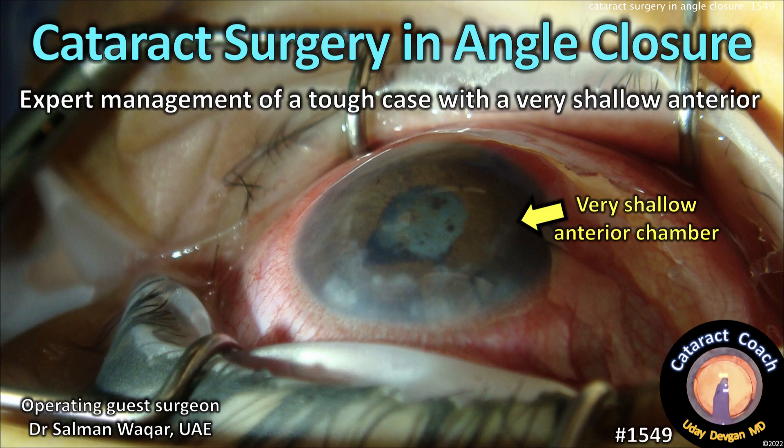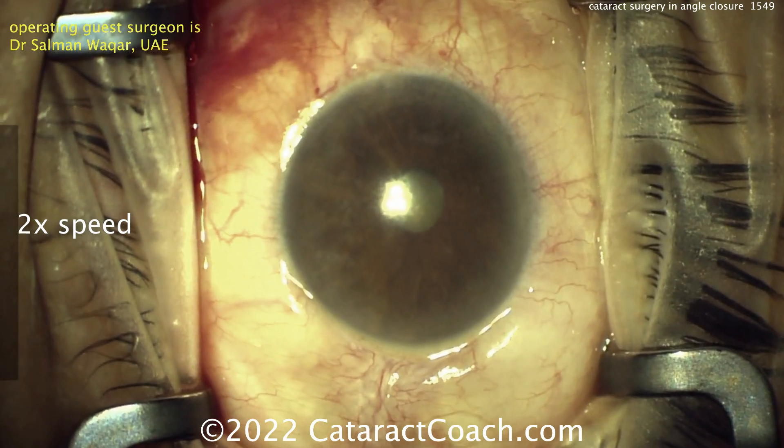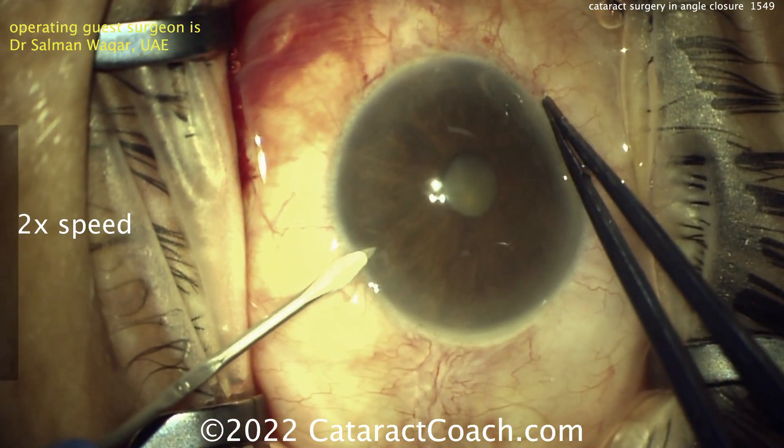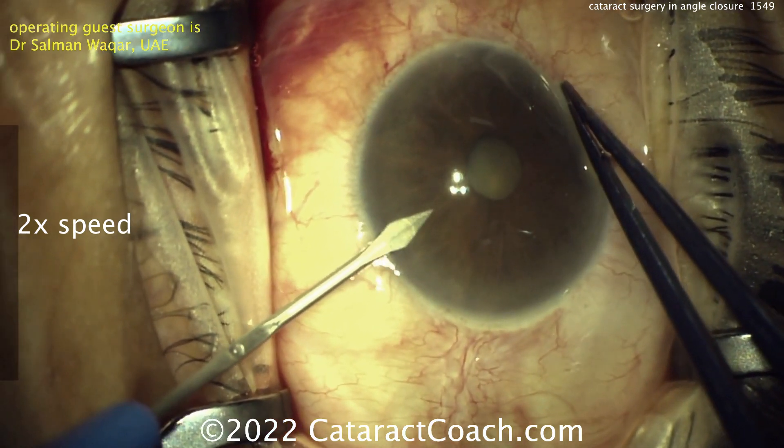CataractCoach.com — cataract surgery and angle closure: expert management of a tough case with a very shallow anterior chamber. Our guest surgeon sent this video in showing a patient who had chronic angle closure; anterior chamber depth is about 1.5 mm only.